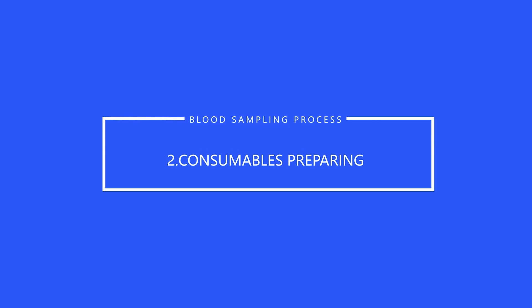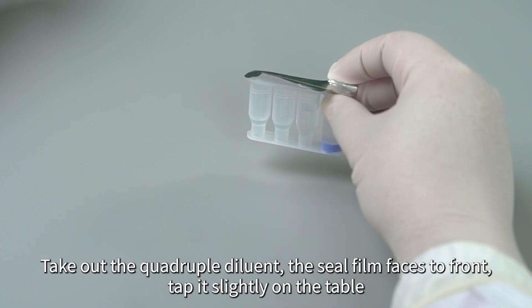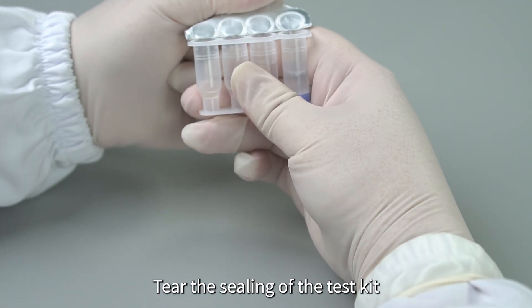Consumables Preparing. Take out the quadruple diluent. The seal film faces to front. Tap it slightly on the table. Tear the sealing of the test kit.